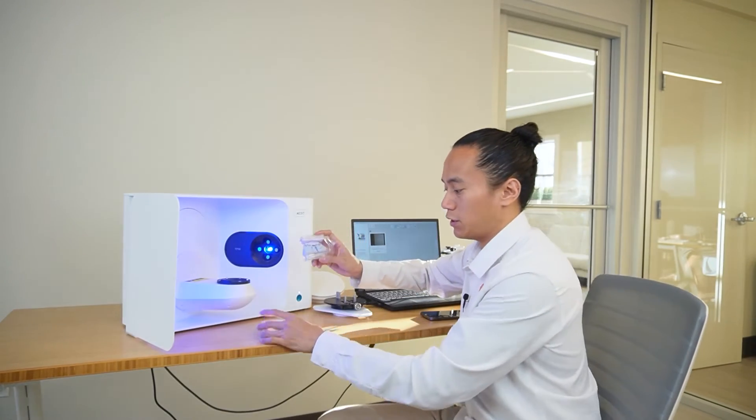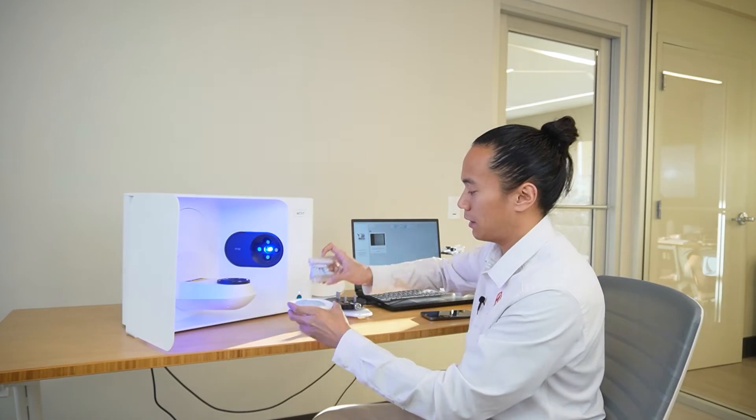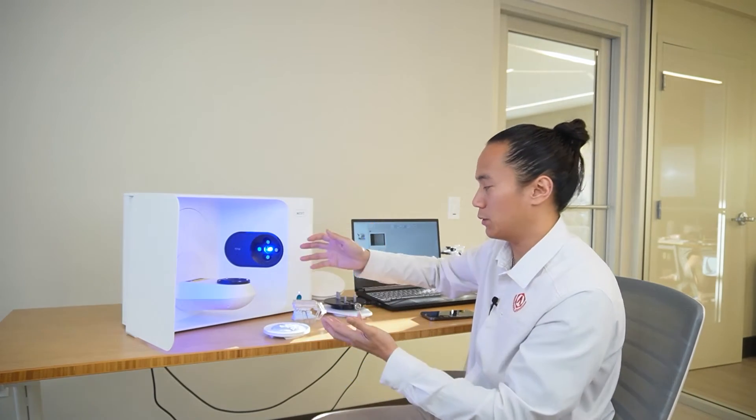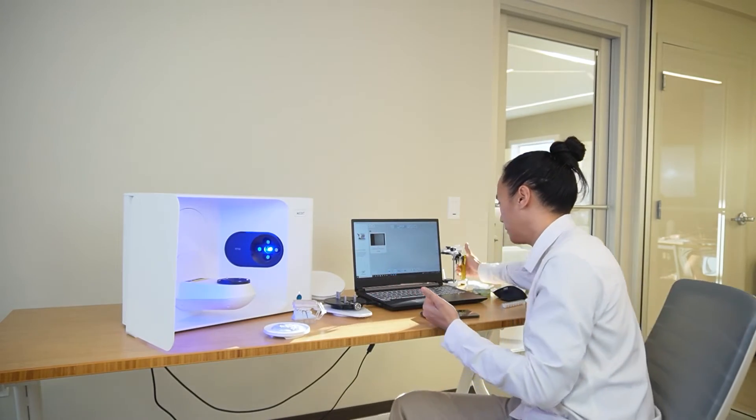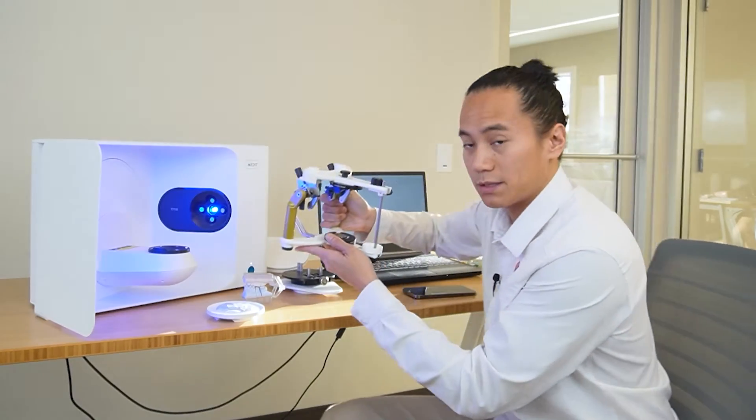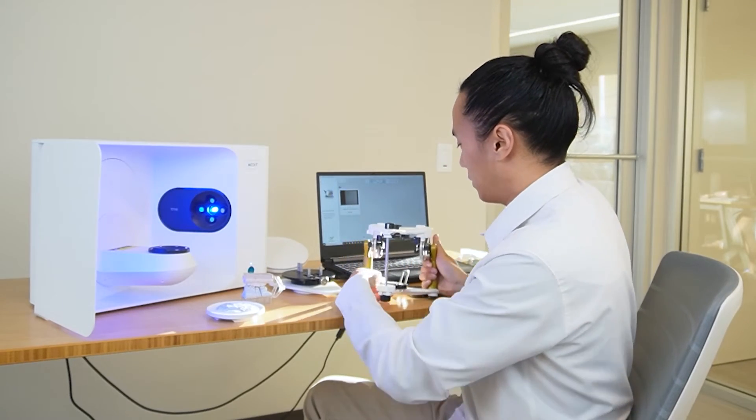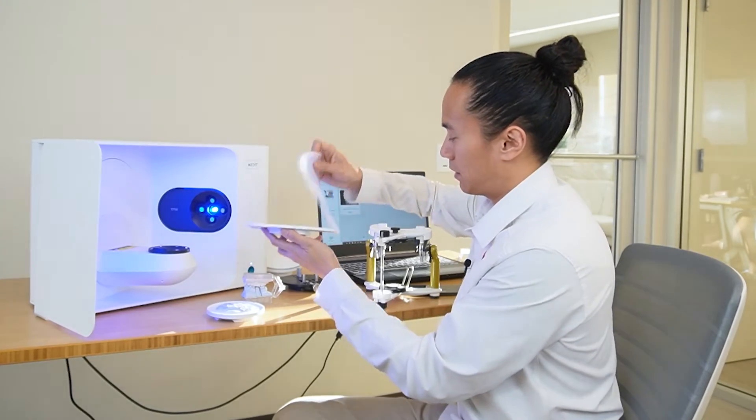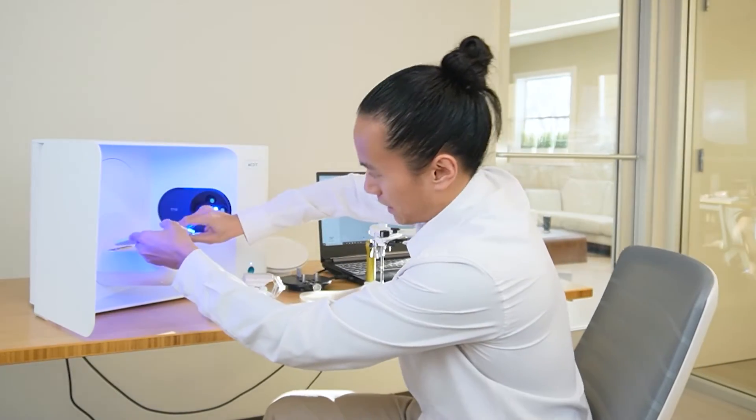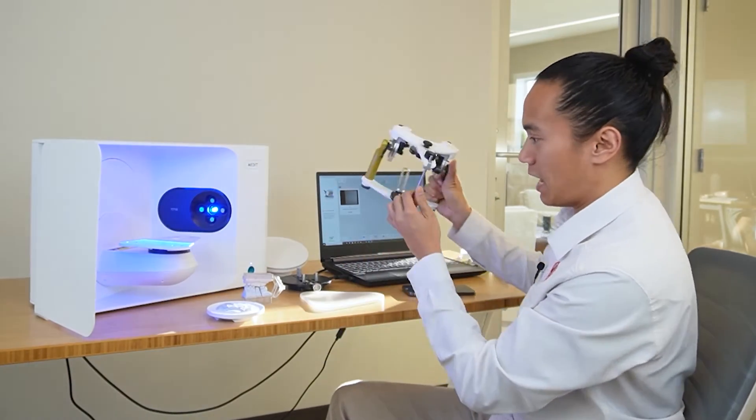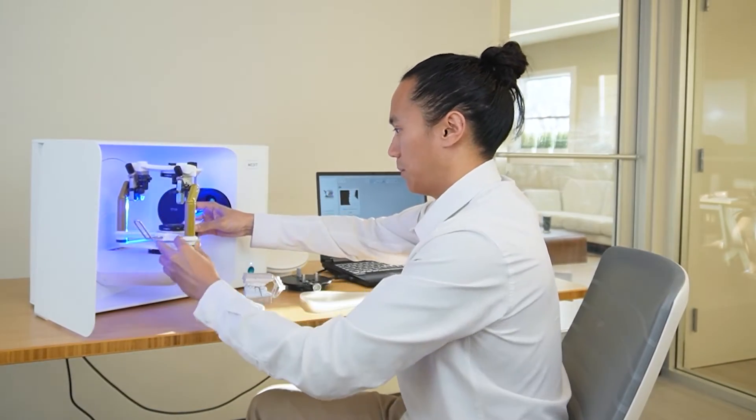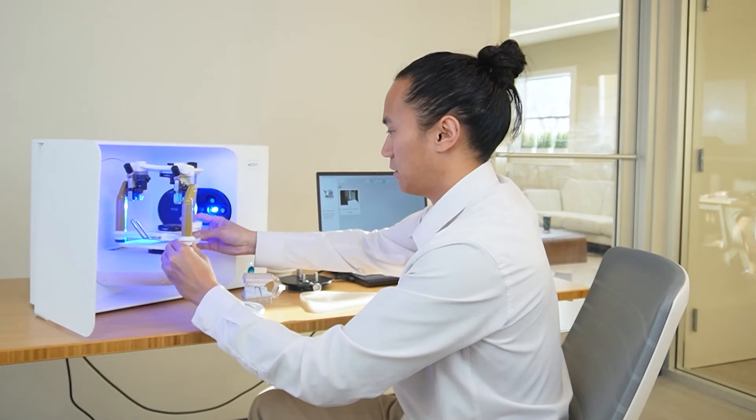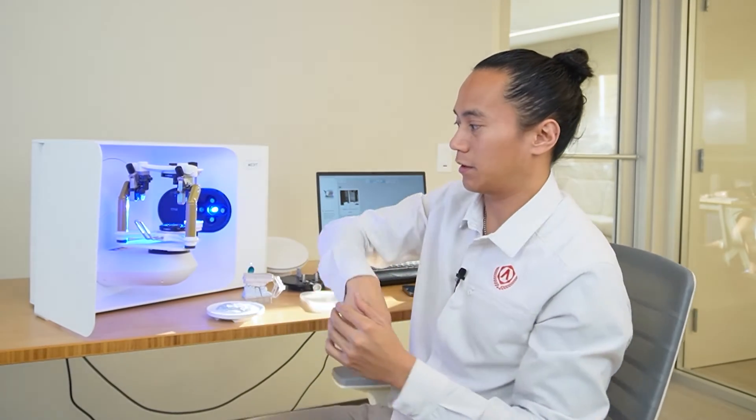But if we had a case that warranted the use of a full articulator that we had mentioned before, something like this, we would actually use the articulator base plate instead. So we would just take the articulator base plate, place that right here, and then take your articulator and center it as best you can along the plate here and scan it this way. Obviously, we would probably want to also remove the pin.